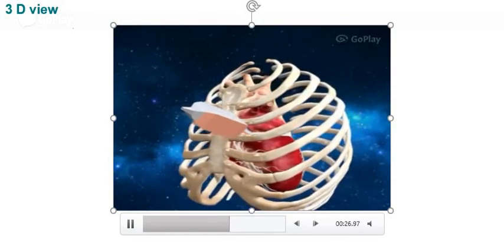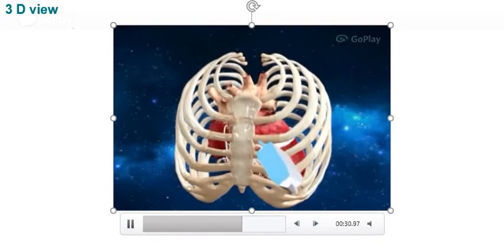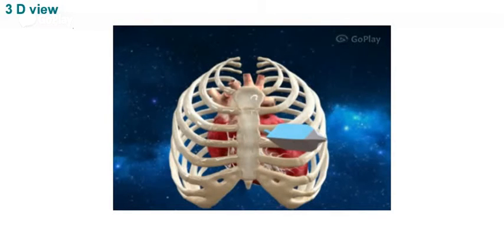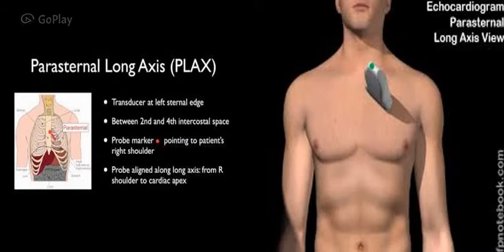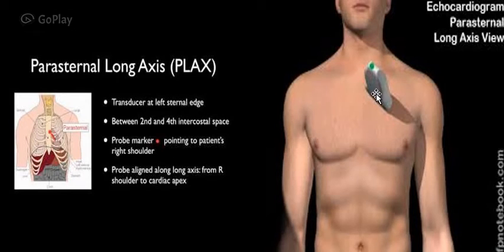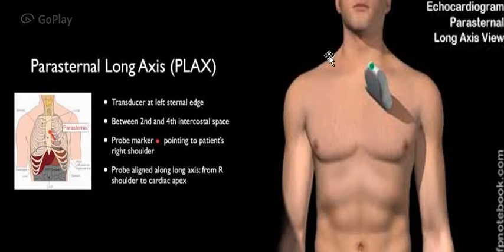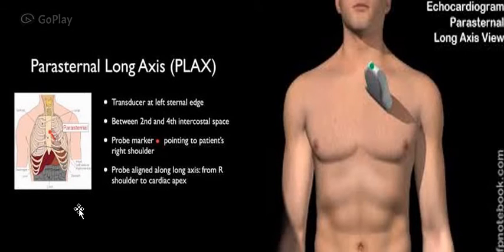In this 3D image, the pointer is directed towards the right shoulder of the patient, lying parallel to a line joining the right shoulder and the left groin. The probe is placed mostly in the second or third intercostal space, and sometimes the fourth, at the left sternal edge. The transducer pointer is directed towards the right shoulder, along a line from the right shoulder to the left iliac crest. The probe should be oriented along the long axis, from the right shoulder to the cardiac apex.